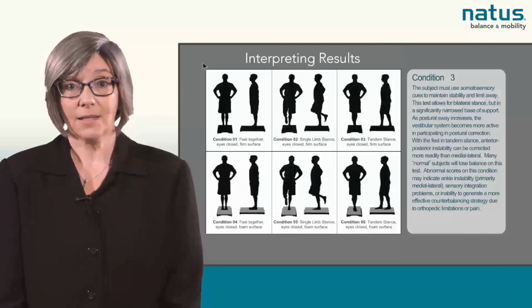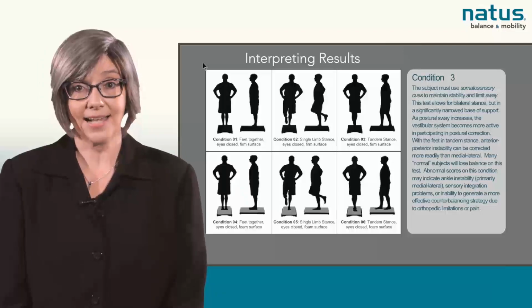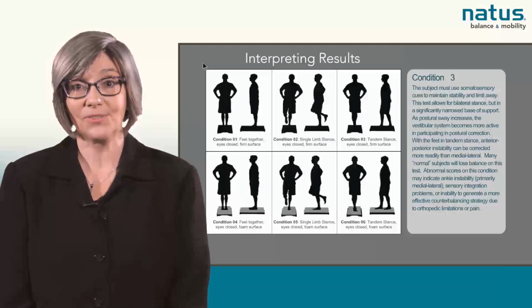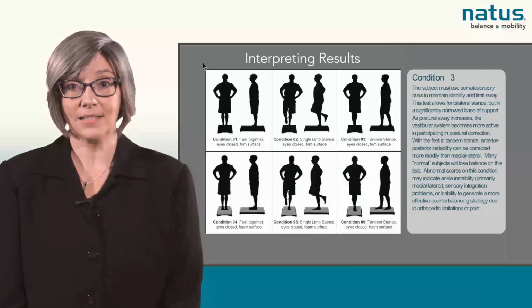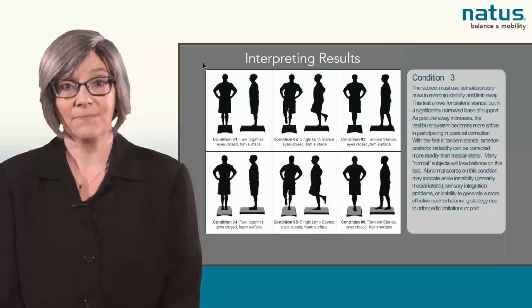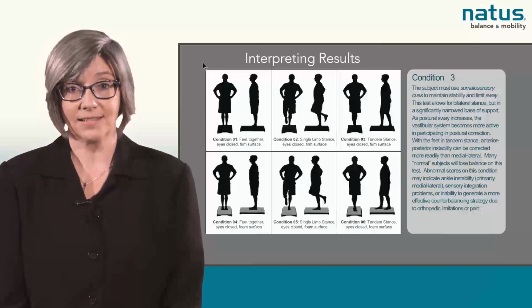Condition 3, the patient is standing in tandem stance on a firm surface with the hands on the hips and the eyes closed. The patient must use somatosensory cues to maintain stability and limit sway. The patient's base of support is significantly narrowed with tandem stance.